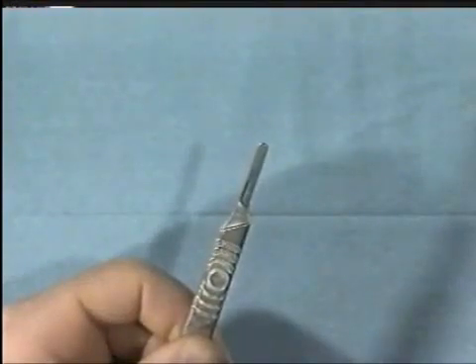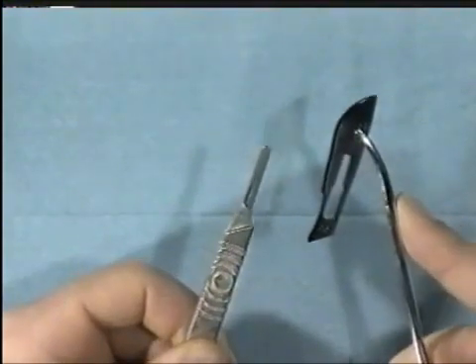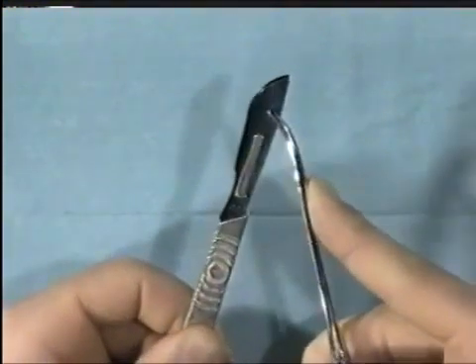When handling the scalpel, never handle the blade with your fingers — always use a hemostat as seen here. Slide it onto the handle gently.